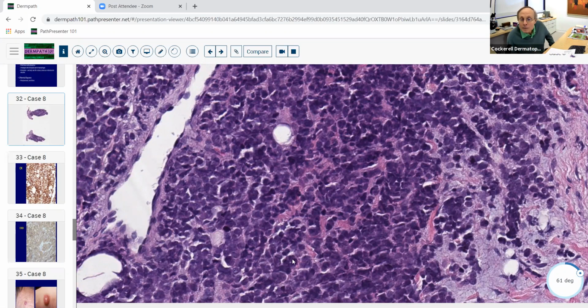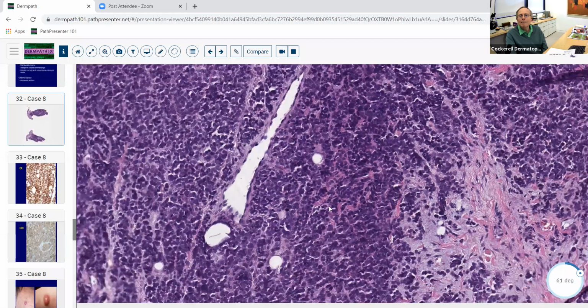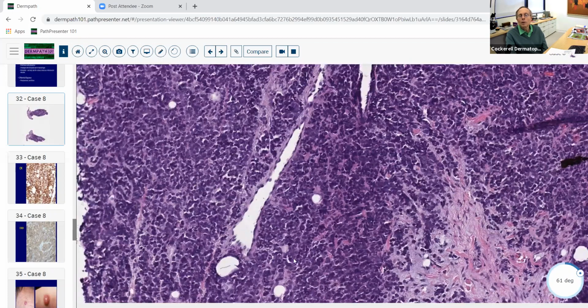Now, one clue that you look for is this little pale, pinkish discoloration right around the nucleus. You see that same sort of thing a little bit in a plasma cell when it's got immunoglobulin in there, but this is not actually the same thing. This is a tiny pink dot almost right at the edge of the nucleus. That correlates with the paranuclear dot pattern of staining with cytokeratin, CK20, when you do that stain. So if you see that on H&E, that helps you think, well, this may be a Merkel cell carcinoma or neuroendocrine carcinoma. You don't have to see that.